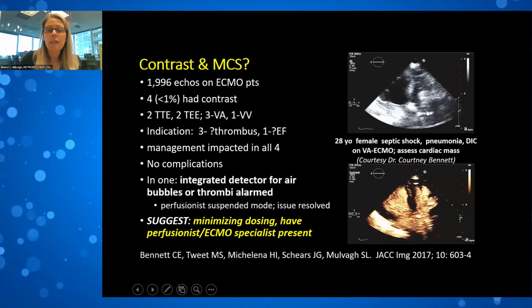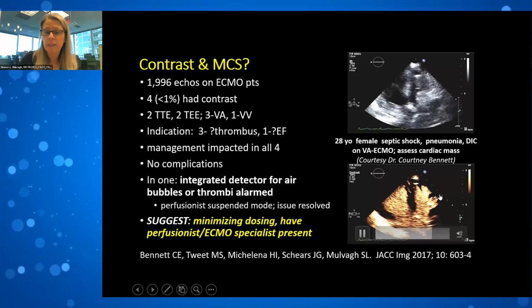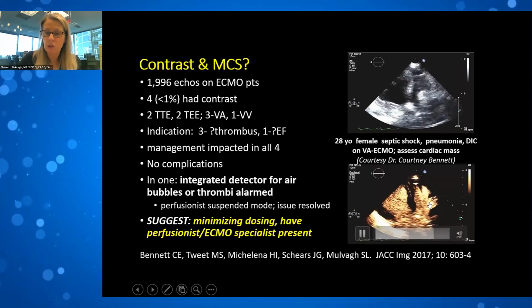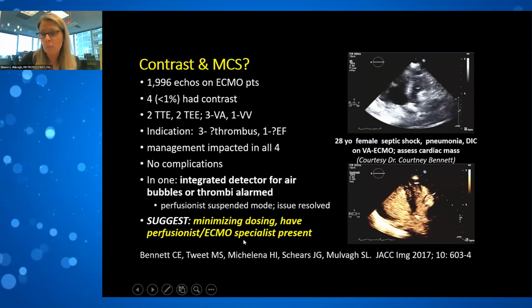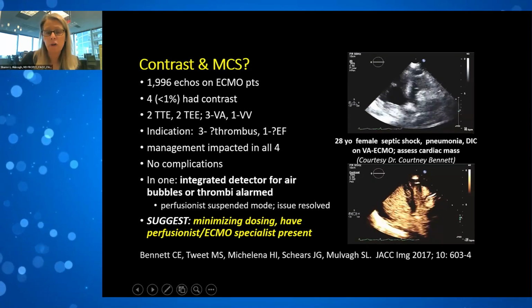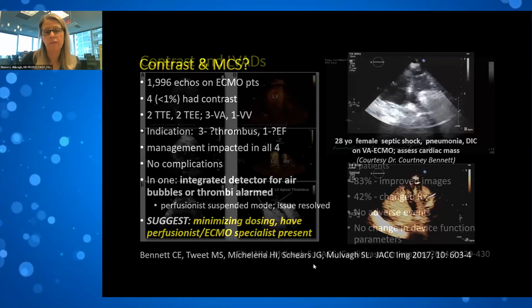And we did look at our data in patients that were on ECMO and found that, yes, it can be very helpful. Here it clearly outlined this mass, which was extracardiac in this patient who was on ECMO. And it's very safe to use, but the proviso is that you do have a perfusion specialist available, because the microbubbles can activate the alarms in the pump, which could potentially get set off. And so that would be important to have available.